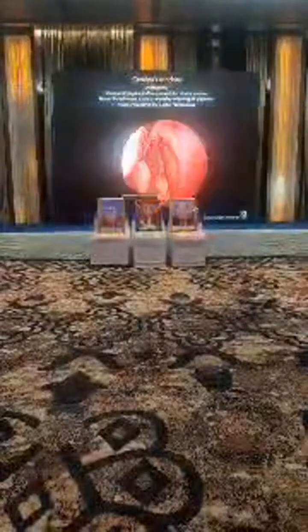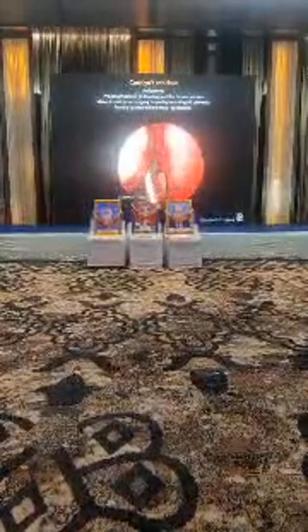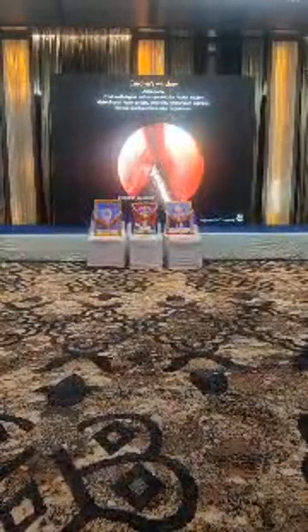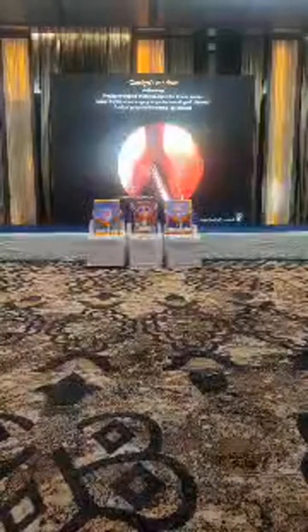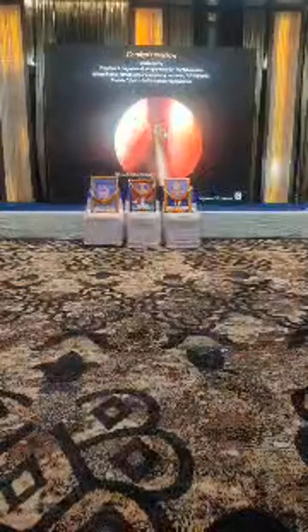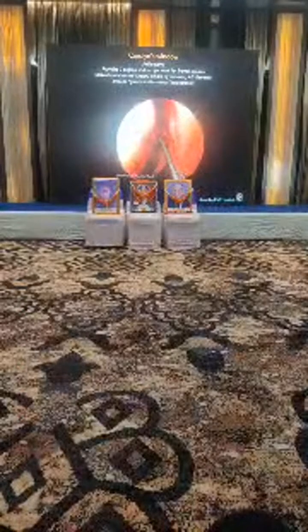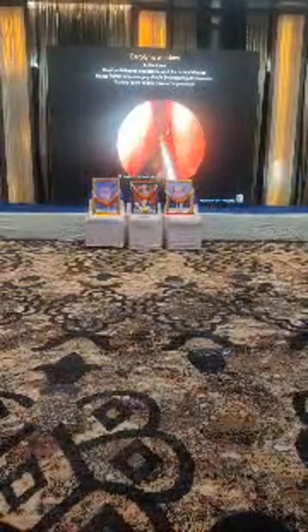This is the small video. This patient had a frontal disease, isolated frontal disease. This is the left nostril with the middle turbinate. The incision is quite above, up here. As I want to do very minimal surgery in the frontal recess because a single cell is involved in the disease, I have taken this very small incision. That is the elevation of the flap. This is the inferior base flap.